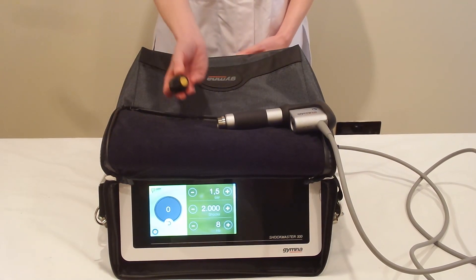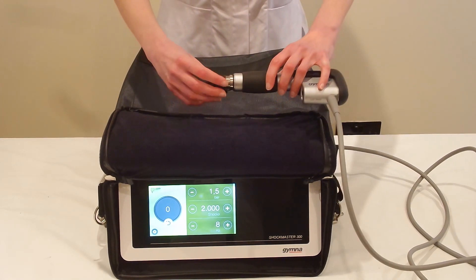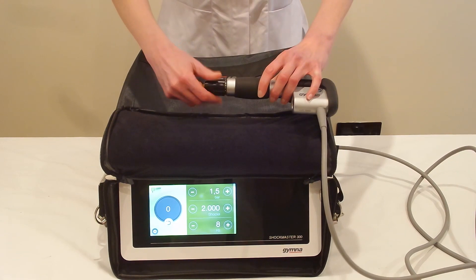We're going to be using the focused head for this treatment, which is the copper-colored 15 millimeter head, slightly concave.